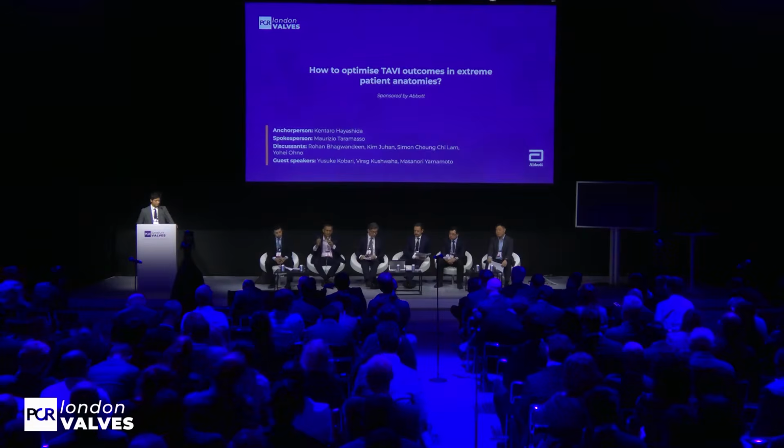Thanks, Kentaro. In the couple of cases that we've had, it's important to understand what the mechanism of the valve failure is. In some instances, it's actually a frozen leaflet. And I don't think we have all the data that we want, but we want to avoid it as much as possible. It really comes down to balancing the height of your balloon-expandable implant versus coronary risk plane versus overhang.